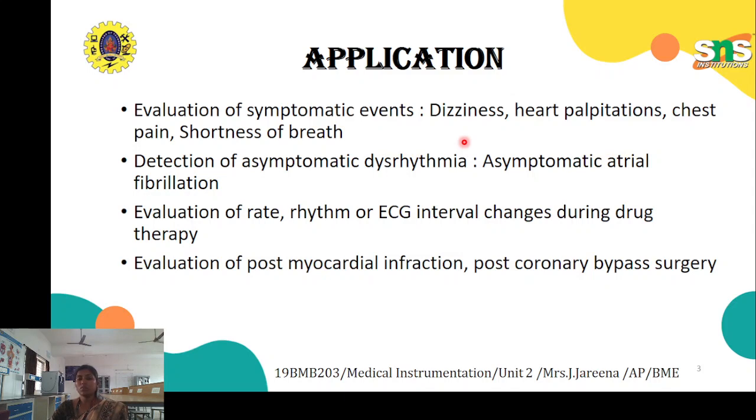In such cases, the doctor will advise going for a Holter monitor, which is also used to detect asymptomatic dysrhythmia. Dysrhythmia is nothing but an abnormal heartbeat. There are some heart abnormalities that occur without any symptoms, and these have to be taken care of immediately. The required treatment should be given at an early stage, or else it may end up in a bad situation.